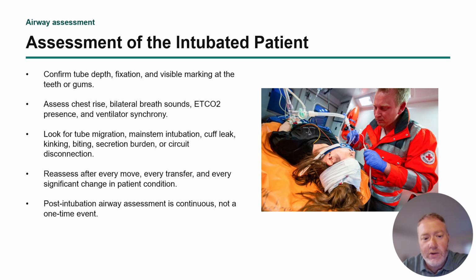Look for any kinking in the tubing. Make sure they're not biting the tube. Make sure they don't have a ton of secretions that are impacting their airway at all. And then, of course, circuit disconnection. So airway assessment should be conducted after every move, every transfer, every significant change in the patient condition.